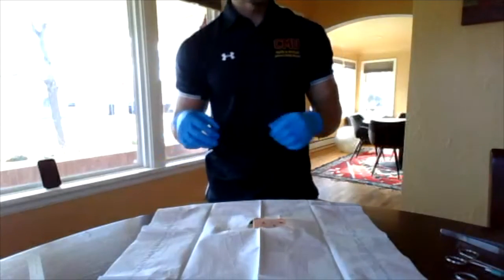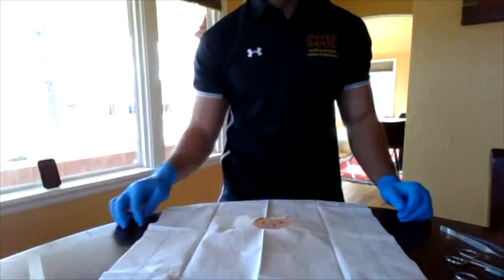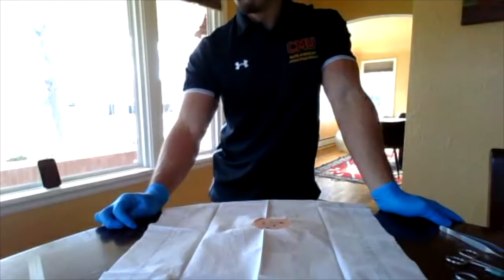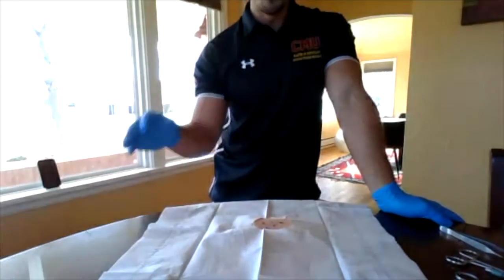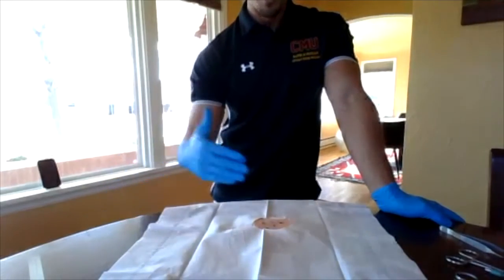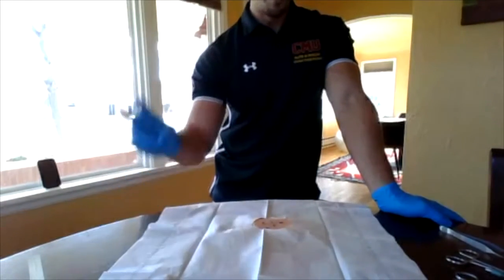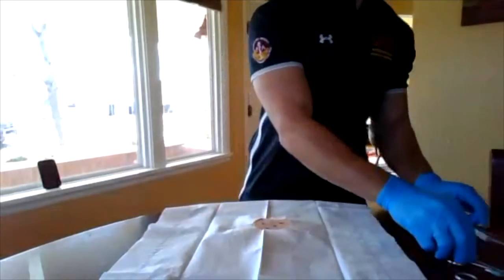The next step is we're going to suture the biopsy site. The general rule of thumb is that however wide the diameter was, you're going to do half that for the number of sutures. Ours was 5, so technically it's 2.5, but we'll put 3 sutures in.